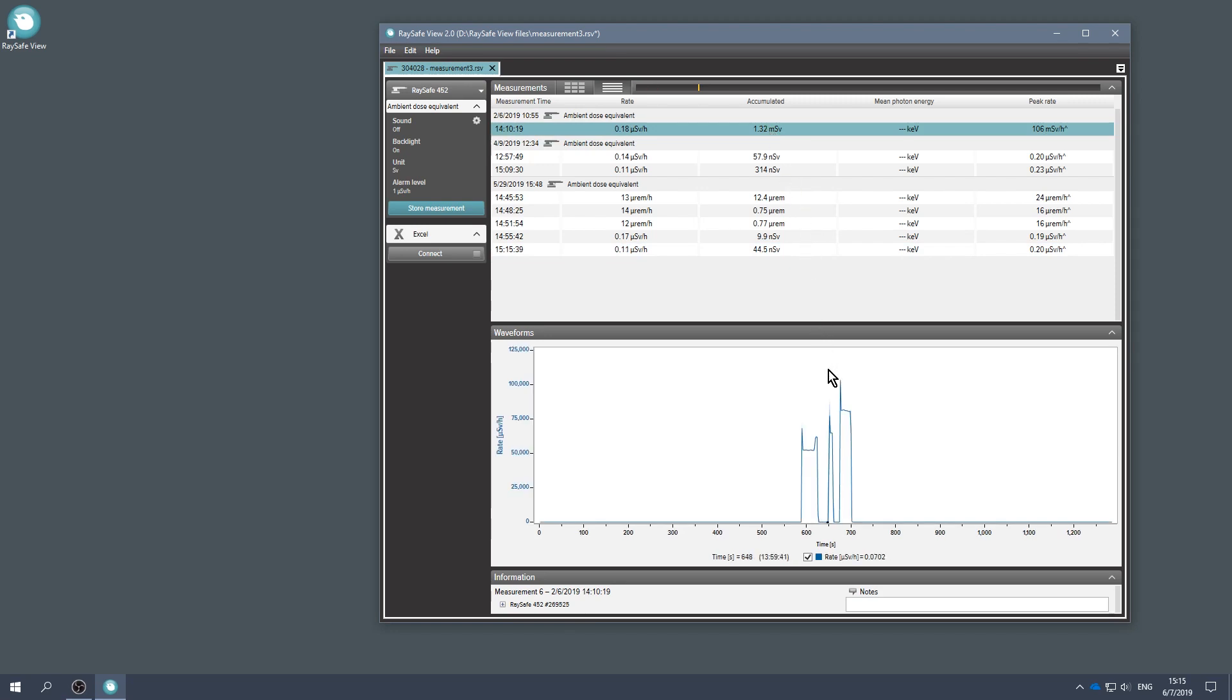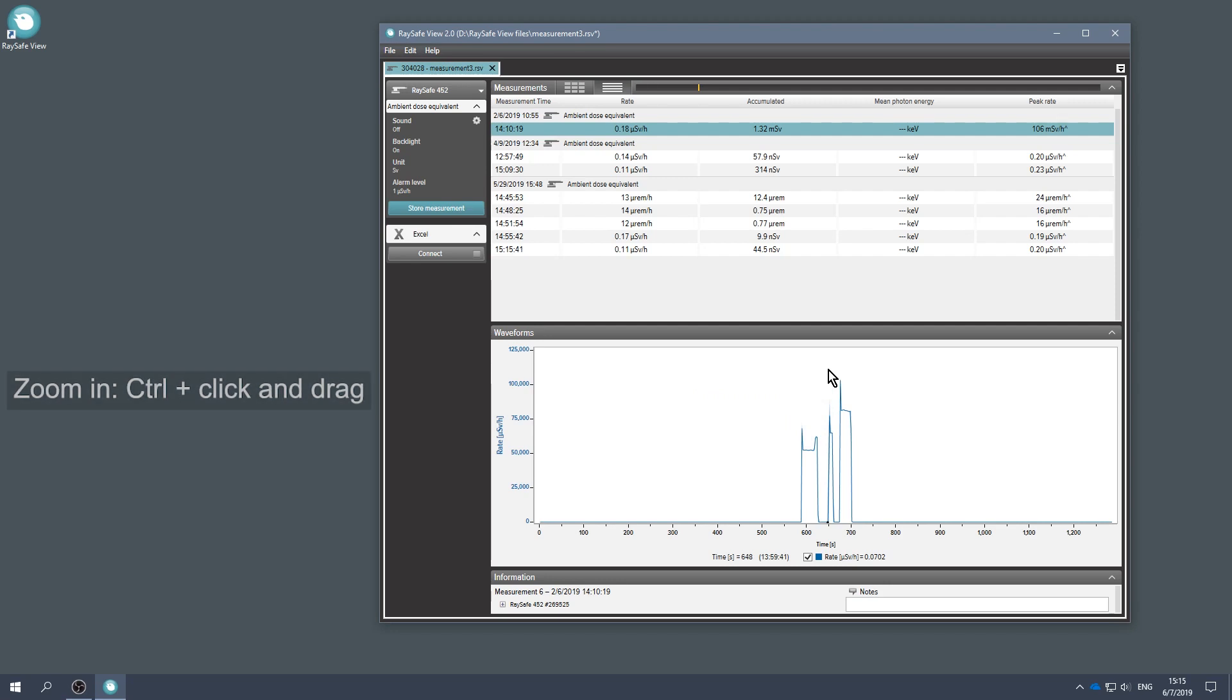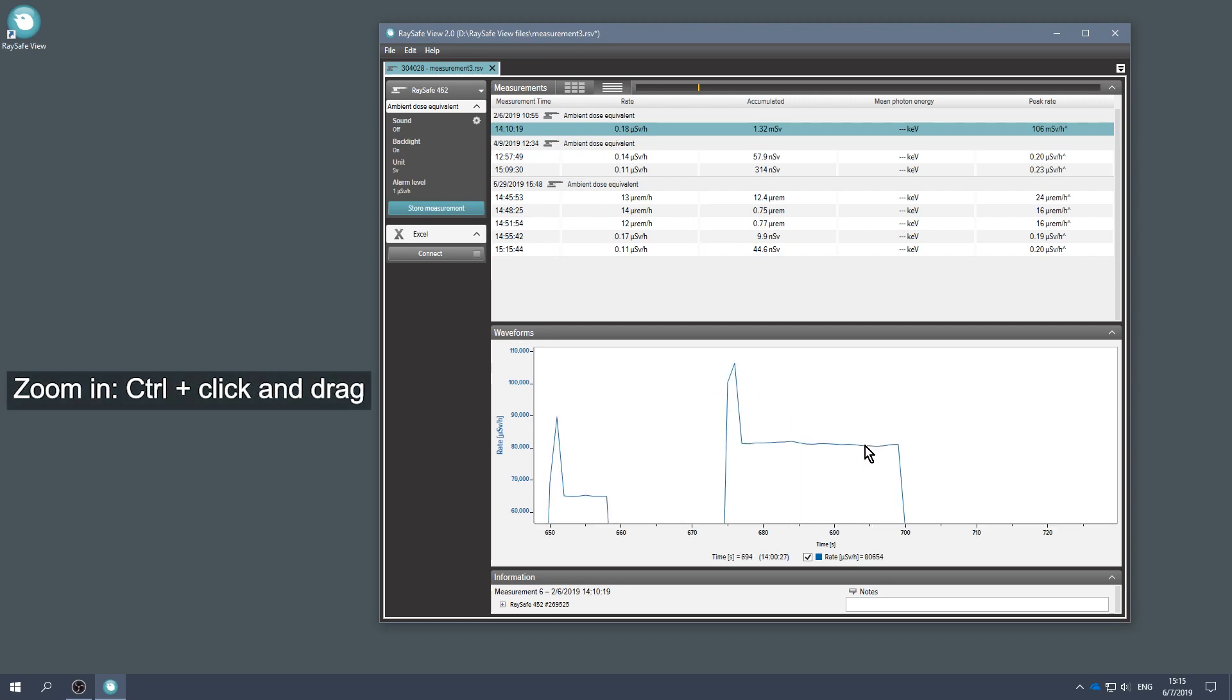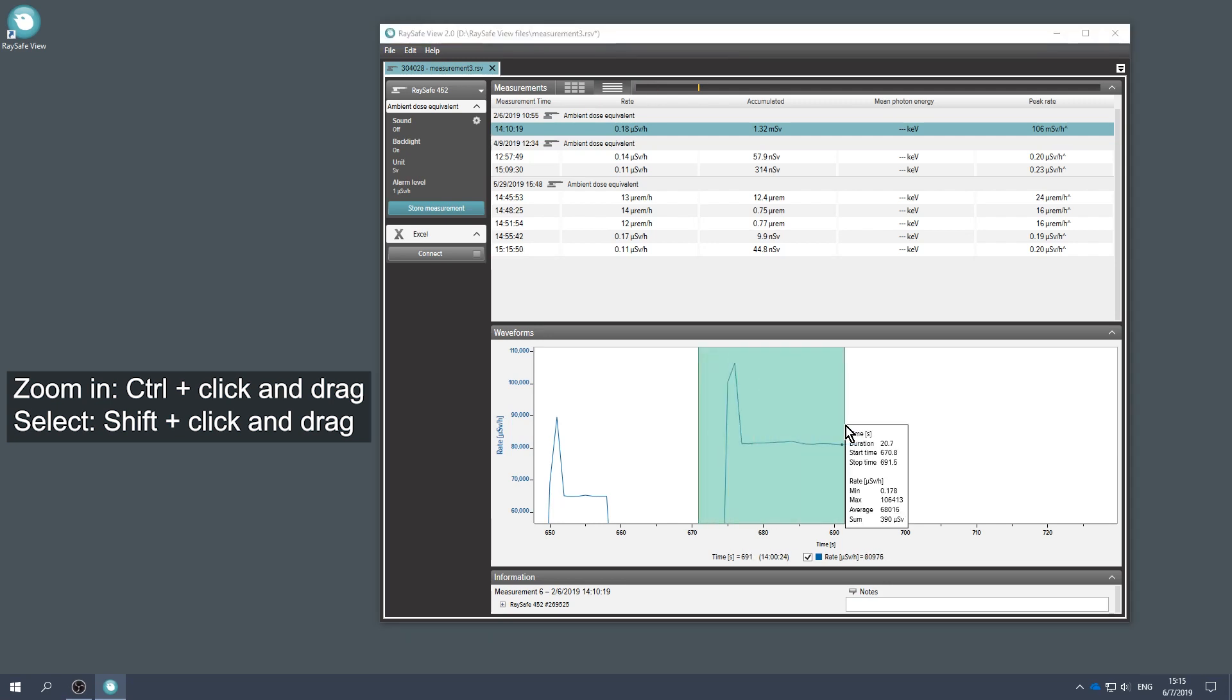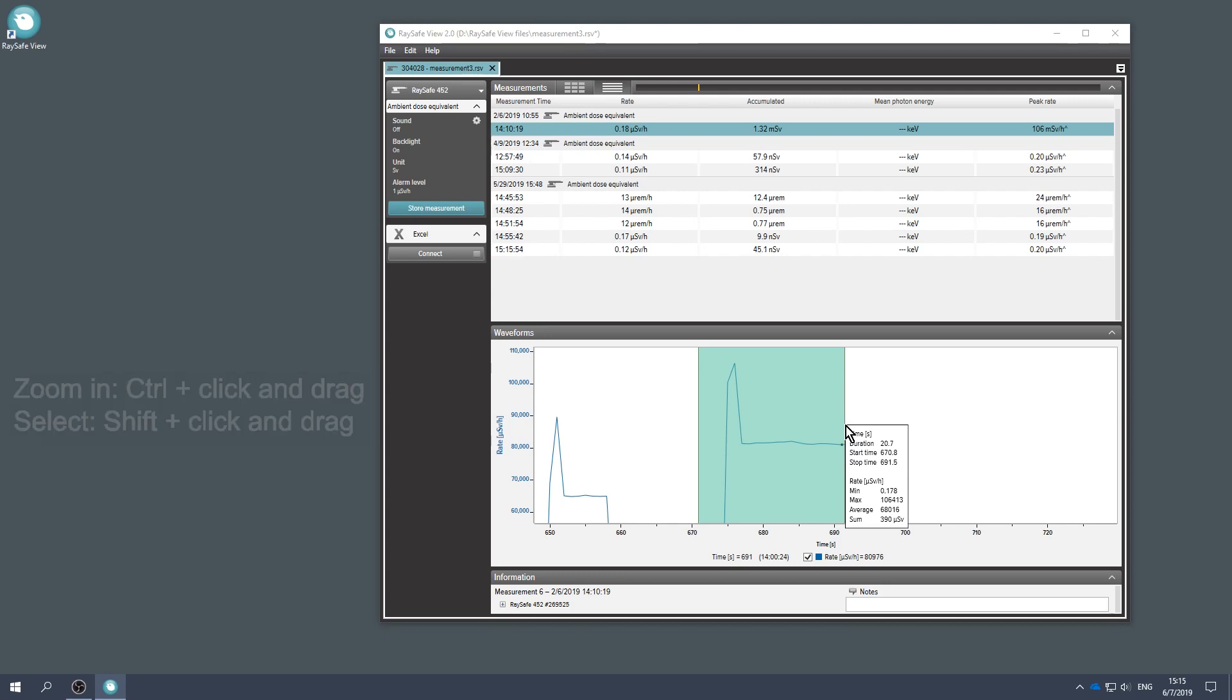I'm interested in the dose rate value of this peak. Press Ctrl, then click and drag to zoom in. To make a selection, press Shift and then click and drag. Here you can see some data, for instance the maximum dose rate for the selection.